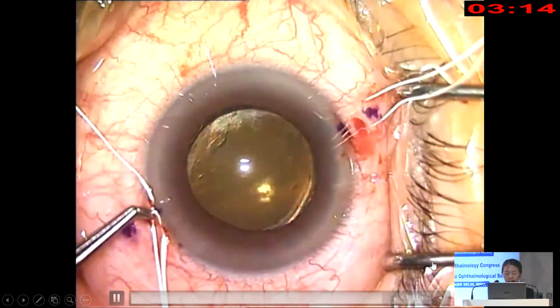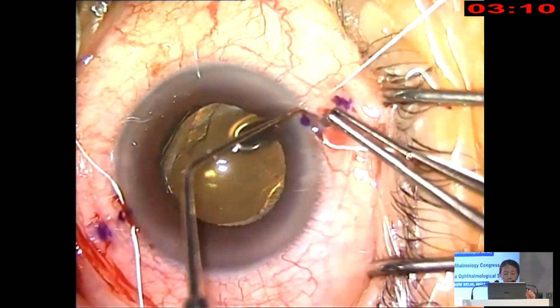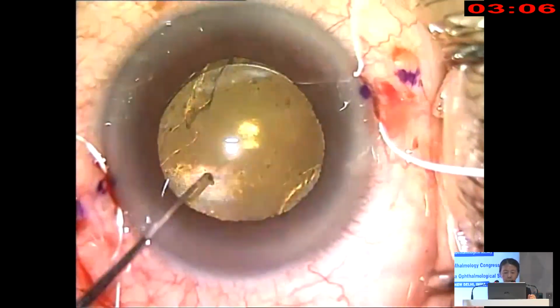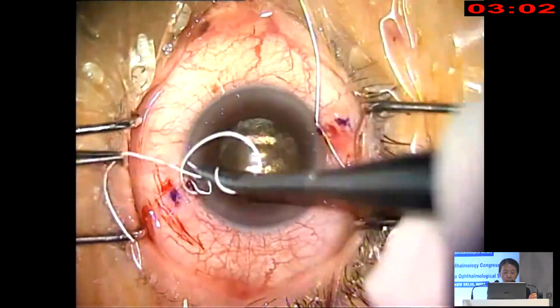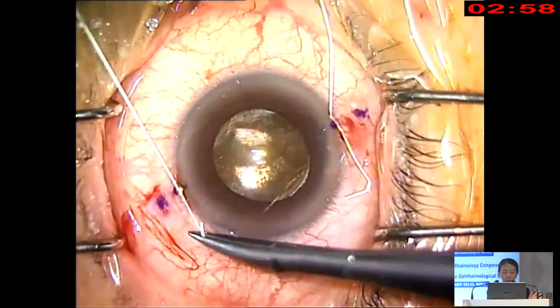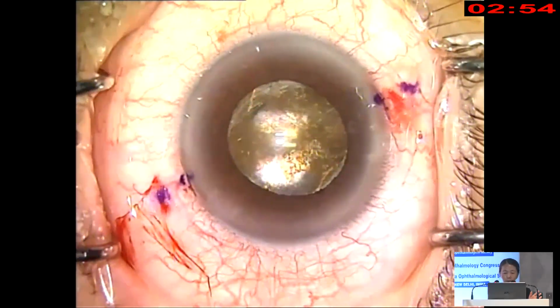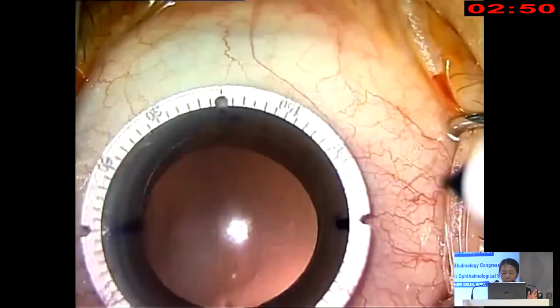And when you've done that, again, no tension, all right? As long as your sutures are adequately against the haptic, all right, then you just tie 2 on 1. You can see me doing that routinely. It's the same on either side, and then you tie down 2 more throws, and you put that back into the Hoffman pocket. All right, so that's simple. Let's have a look at this other case. Where's the lens?